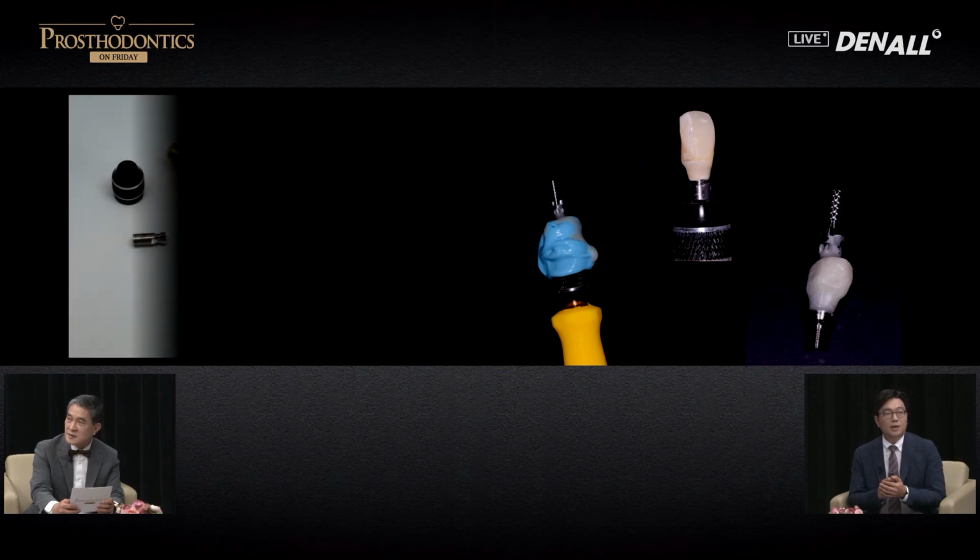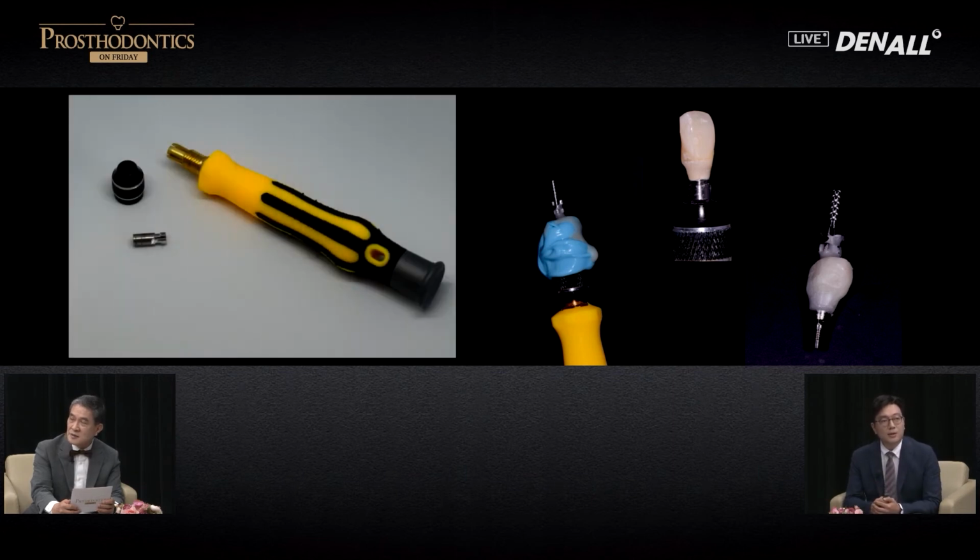Holding it, this is a screwdriver pin vise. You can connect it to the analog, and it can be a handle or holder. You can easily put the resin in hot water and take it out with that. So it's not sold in a dental store, right? You can get it in a hardware store. Yes, it's just a couple of dollars. Very cheap. Yes, I love to use it.